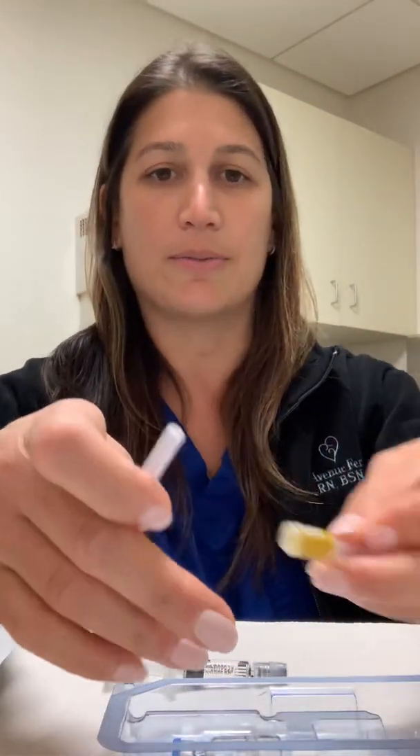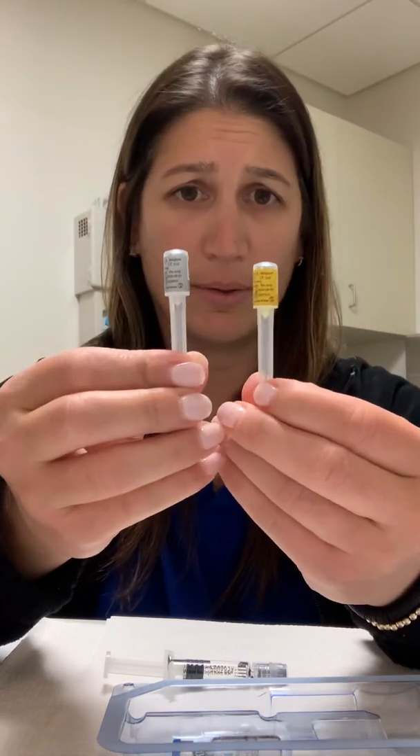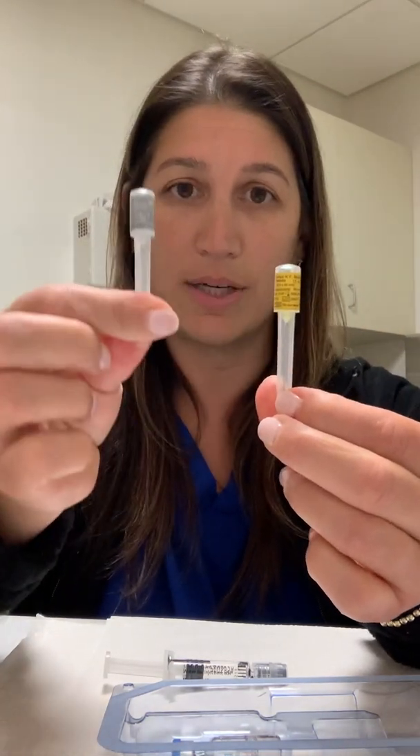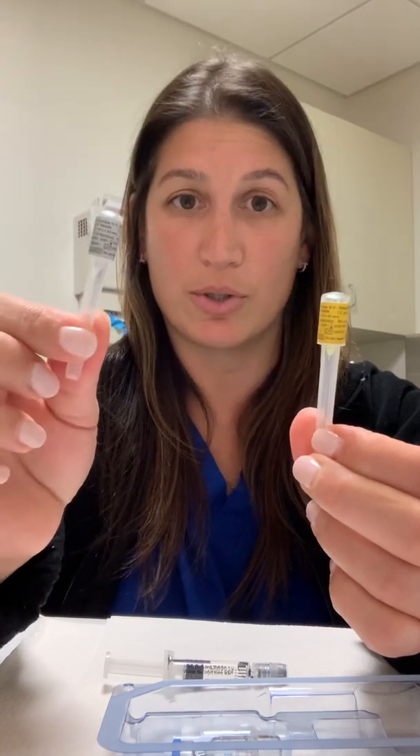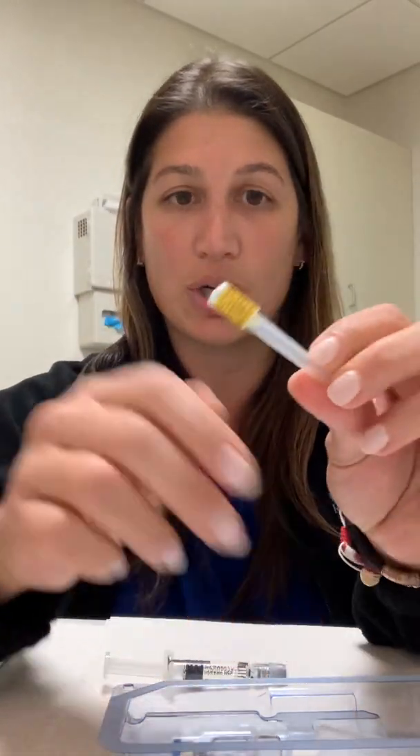For your needles, there'll be two wrapped needles — one will be yellow, one will be gray. The gray is for injection. Unless you're a little bit thinner and you don't have enough inch to pinch, then you would use one of your Menopur needles for injection. But the yellow one is just for mixing.